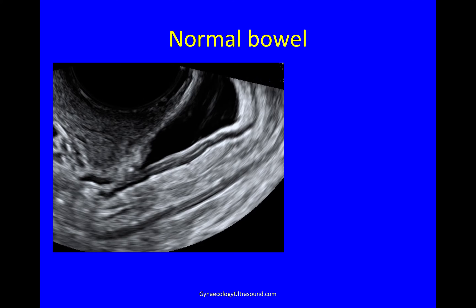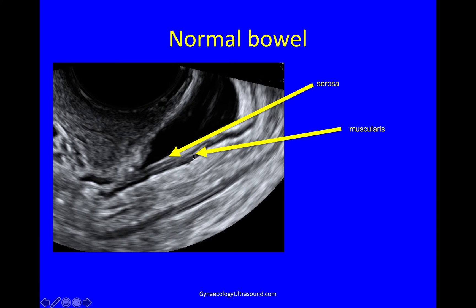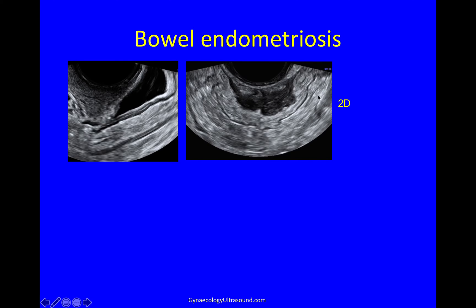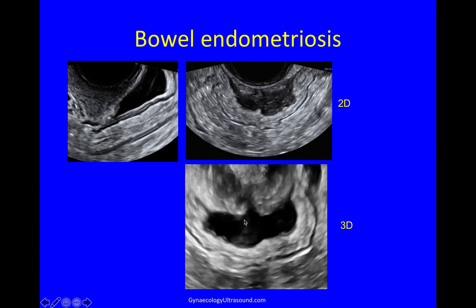Endometriosis is very nicely seen on 3D. Here is a 2D image of normal bowel viewed through the posterior fornix. With a little fluid in the pelvis you can see the bowel layers clearly: the hyperechoic line is the serosa, the hypoechoic line with some hyperechoic signal is the muscularis, then submucosa and mucosa on both sides, muscularis again, and serosa distally. Bowel endometriosis affects the muscularis layer — here you can see normal muscularis entering and exiting, while all of this hypertrophied muscularis is caused by deep endometriosis. On 3D you get a bit more detail.